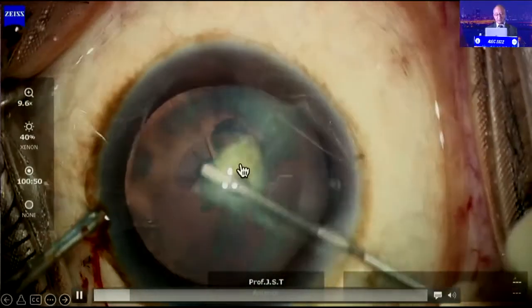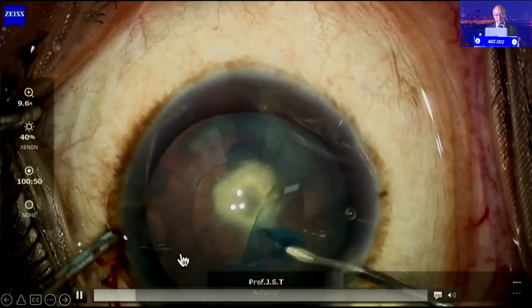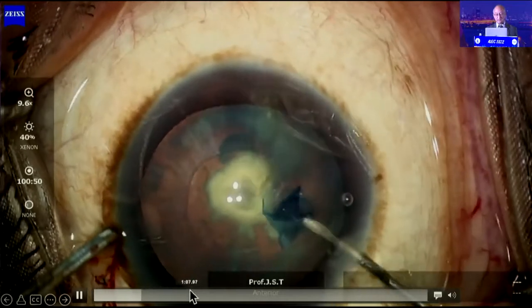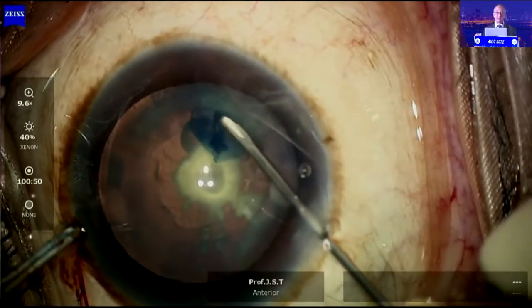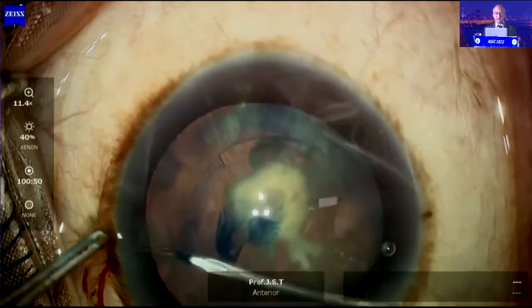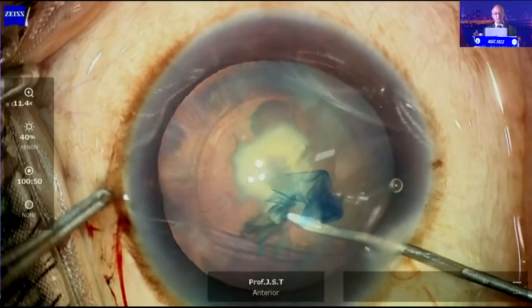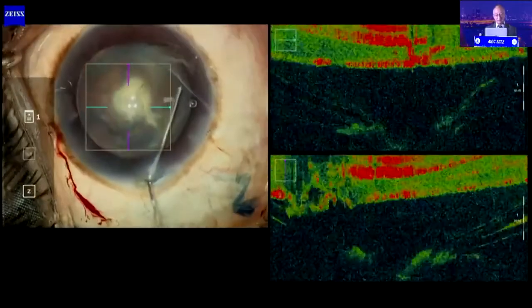The capsulotomy or capsule access should be done after staining. I'm aiming for around a 5 millimeter or 4.5 millimeter access in this particular case. Make sure you take time doing a capsular access in all difficult cases, including a posterior polar. Make it central and circular so that at least you have safeguarded the IOL part as such. You may have to shift from an in-the-bag lens to an in-the-sulcus lens, but it can be done.